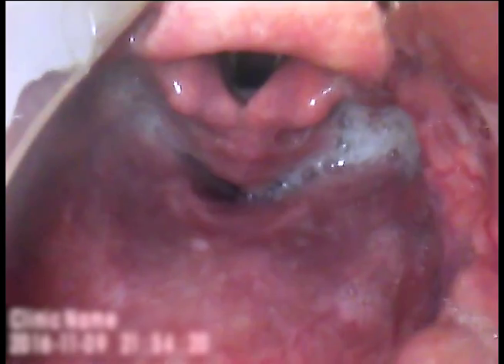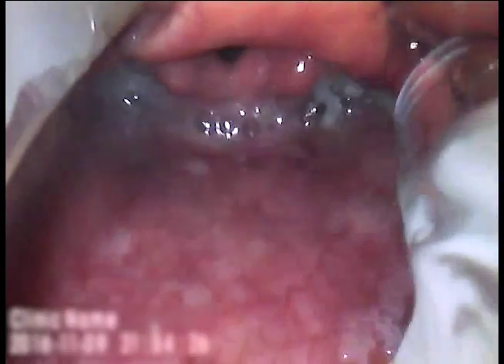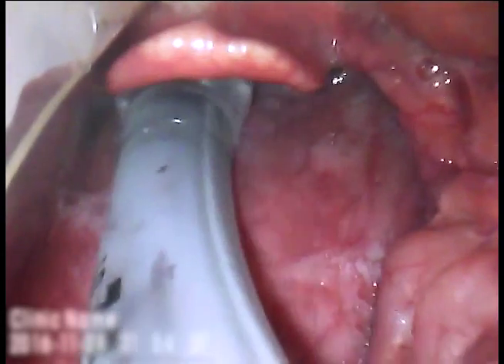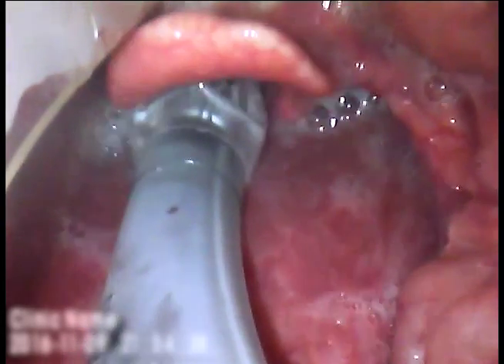The practice of initial epiglottoscopy, as taught by Dr. Richard Leventan, would have prevented this error.